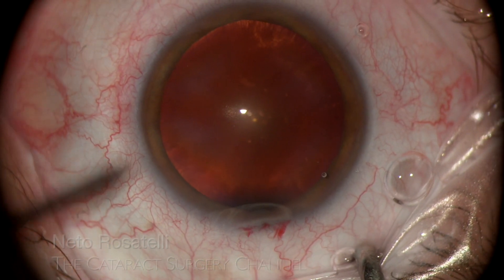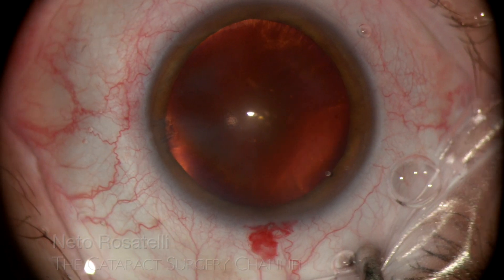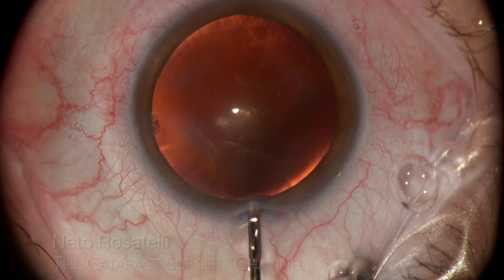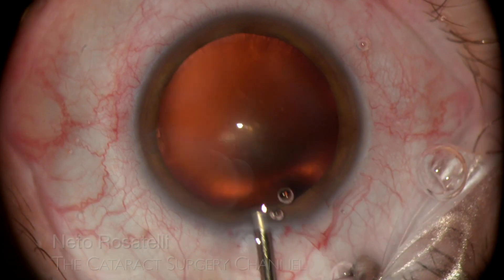A too-long incision in high myopia cases requires a steep instrument approach, causing incision distortion, hampering visualization and predisposing to incision burn. Intracameral lidocaine prevents patient discomfort, as these long eyes are prone to reverse pupillary block.